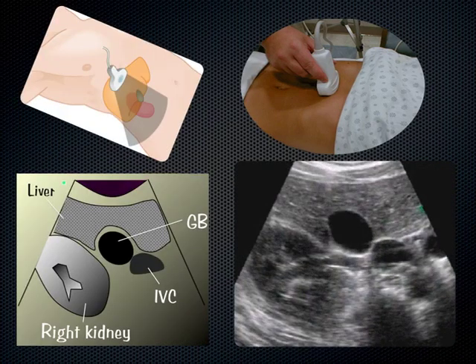And so in the short axis, this is what the gallbladder looks like. Now I know you see a lot of anechoic structures on the screen here. We see this hyperechoic structure here, which is what? The kidney. This is all the liver up here. And we see a circle here. What's this circle here? It's the IVC. Actually, we can kind of, I think, make out the aorta next to it here. Maybe the spine shadow is somewhere down here.